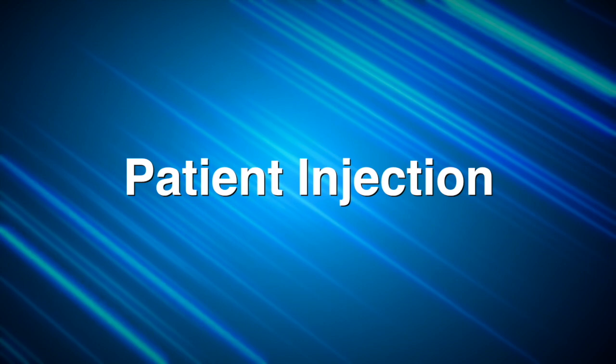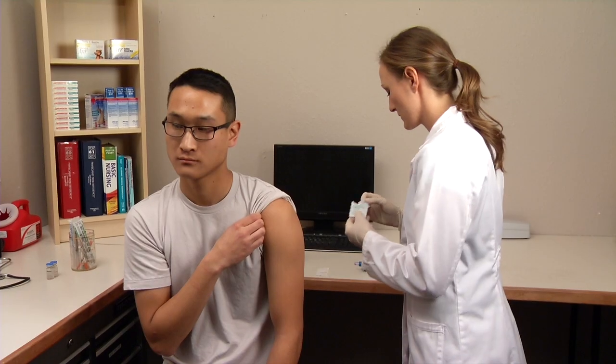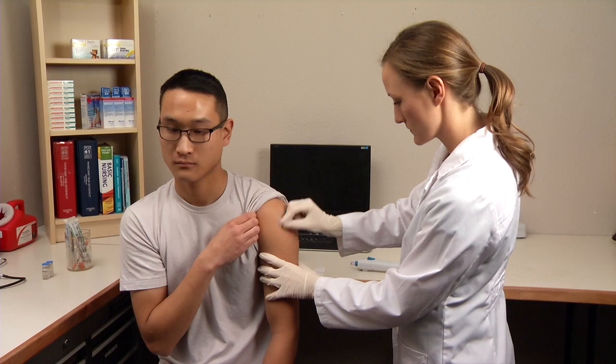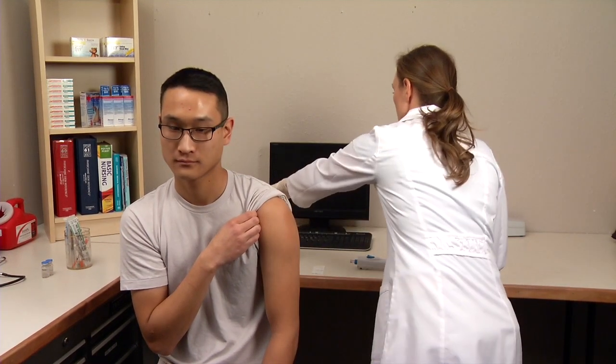Patient injection. Patient assessment and preparing the injection site location should be performed per Centers for Disease Control guidance. Prior to the injection, it is suggested to say to the patient, "Listen for the click." Once you hear the click, the injection is complete.